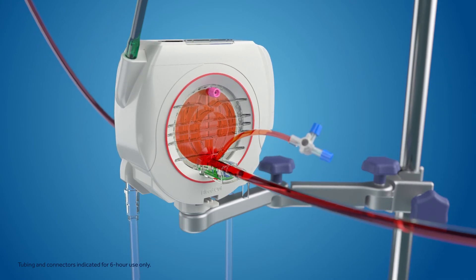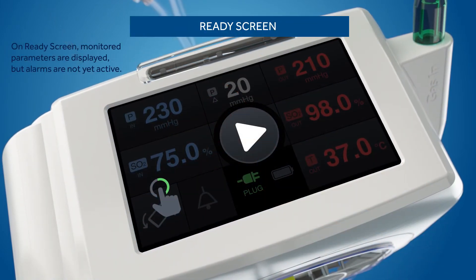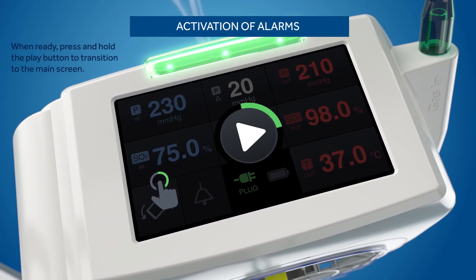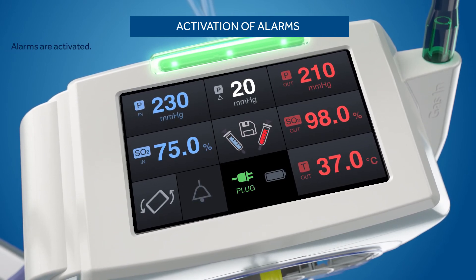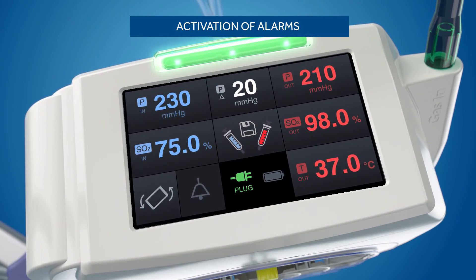Blood sampling can be done at the luer ports located on the blood inlet and outlet. When Nautilus Smart is first powered on, the ready screen will appear. Measured values are displayed, but alarms are not yet active. A press and hold of the play icon activates alarms. Alarm limits can now be set, alarm notifications will occur, and the Nautilus Smart ECMO module is ready to go.